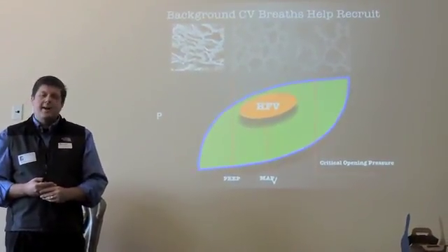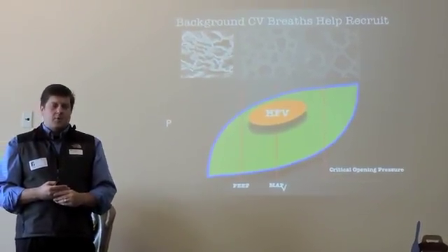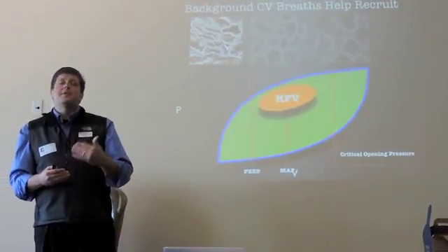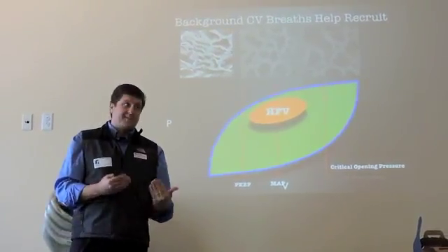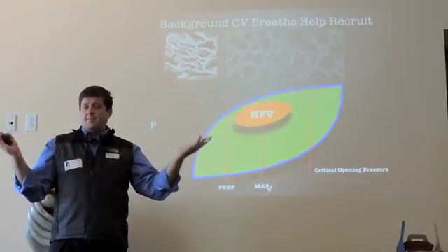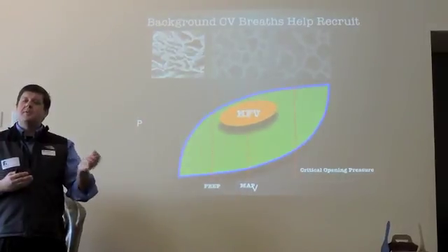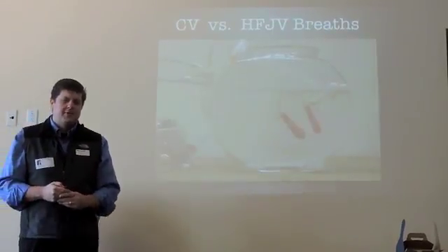And so that's why the conventional ventilator really comes in handy. It's a 2-step process to more effectively recruit the lung, and it's why simply increasing PEEP sometimes doesn't work. Now, when we have oxygenation issues, increasing PEEP or your mean airway pressure should be the first thing we do. But if you go up by a centimeter or 2 and it's not working, then even without getting an x-ray, put on a background rate. I'll tell you, you probably have some atelectasis, right? Because every intubated baby gets some atelectasis. That's where you could simply turn on the background sigh breath and recruit the lung, doing a temporary lung recruitment maneuver, maybe only 20 or 30 minutes.